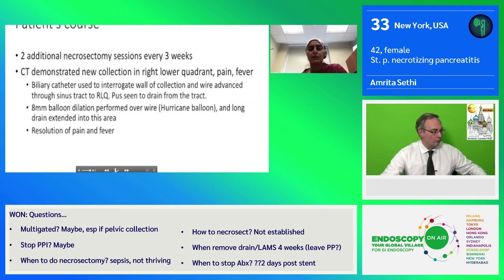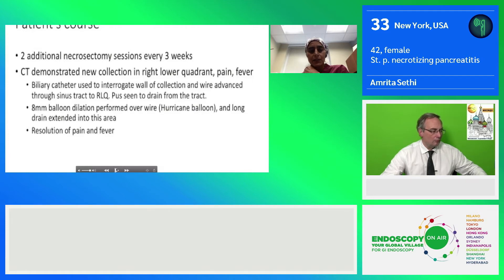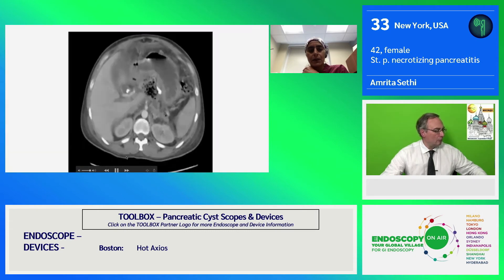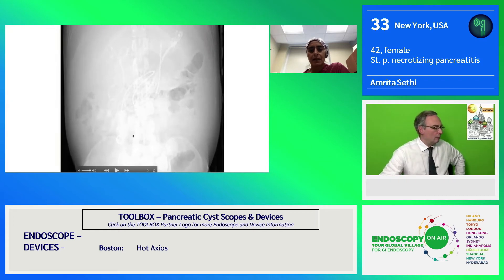The patient had two additional necrosectomy sessions, approximately three to four weeks apart. On his second necrosectomy session, a CT showed a new collection in the right lower quadrant, and the patient did have some pain and fever. During that session, we interrogated the wall of the collection and were able to advance a wire through a sinus tract to the right lower quadrant, and pus was seen to drain from that tract. Balloon dilation was performed over the wire, and a long drain was extended into the collection itself. You can see some images of the balloon dilation of that tract, and ultimately a stent could be placed all the way into that communicating collection.